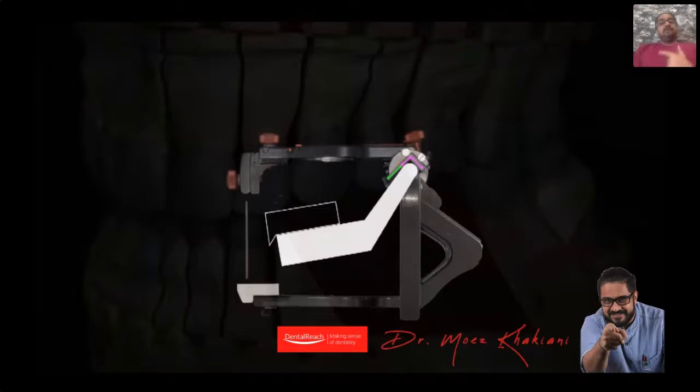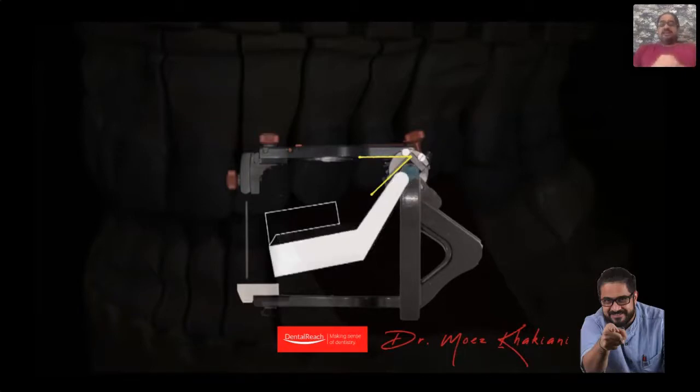So now remember reading Christensen's phenomenon. When you protrude your jaw forward, there is separation of the back teeth. Okay. Now here on the articulator, this represents H value. This is called the horizontal condylar guidance angle, which is nothing but the angle of the articular eminence. On the articulator, as well as in the patient's mouth, when we translate the jaw forward, recognize the fact that there is separation of the back teeth.